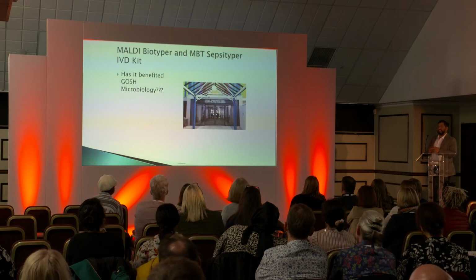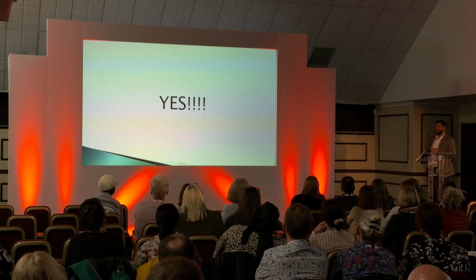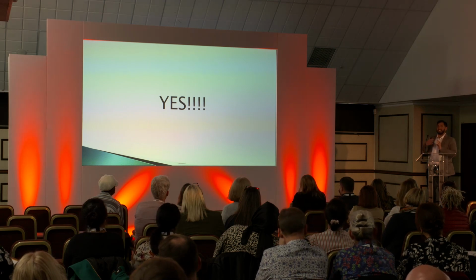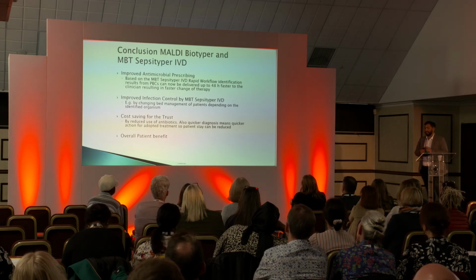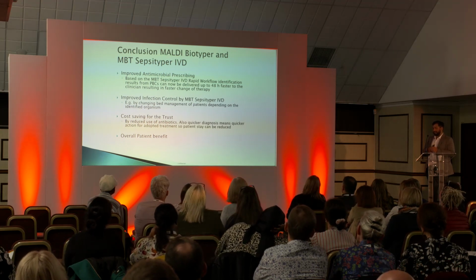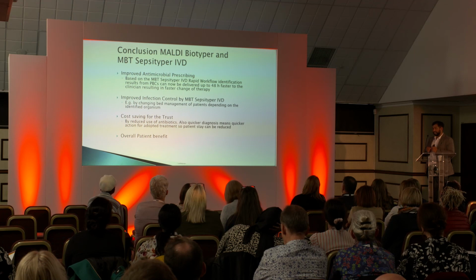So just to summarise, has the Malditof benefited GOSH microbiology? Yes, greatly. The workflow, but not just for the laboratory. I think in terms of getting results out to patients, changing that treatment and management. So just to conclude and summarise, it has improved antimicrobial prescribing based on the MBT Sepsityper IVD rapid workflow. Identification results from positive blood cultures can now be delivered up to 48 hours faster to the clinician, resulting in faster change of therapy.